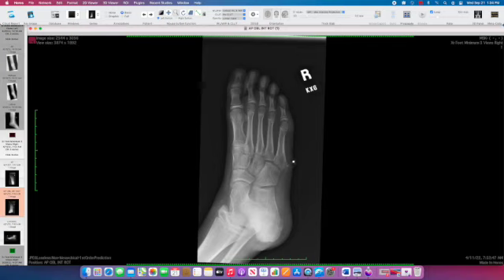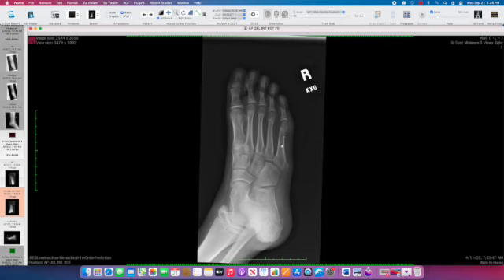We can distinguish this from a fracture given its orientation, which is longitudinally oriented and parallel to the fifth metatarsal base. If it's transversely oriented, it would be more likely to be a fracture.